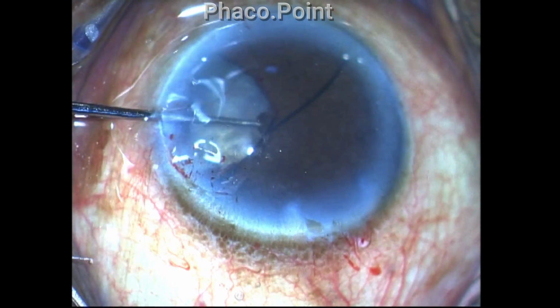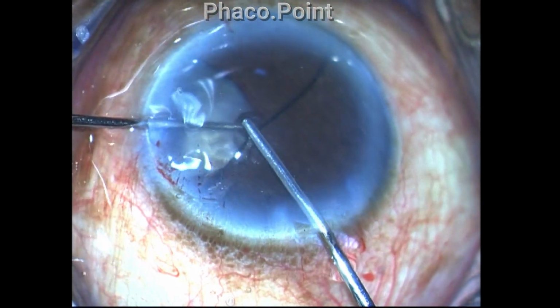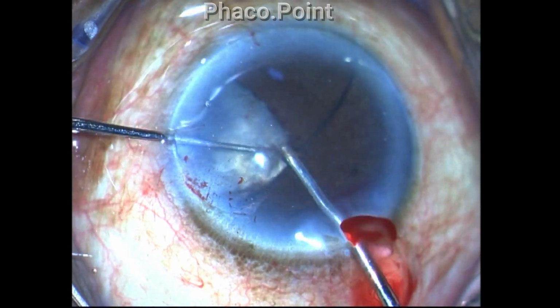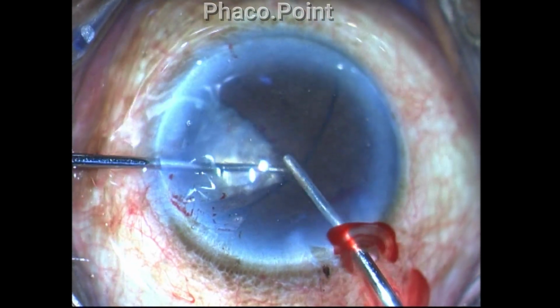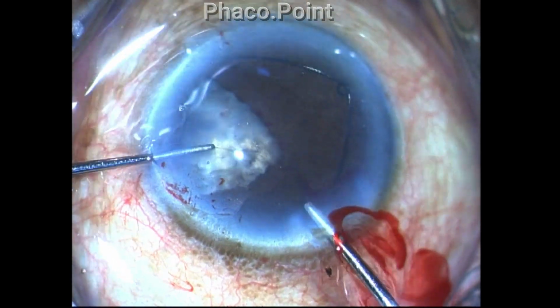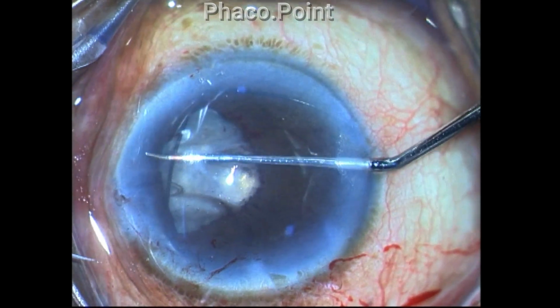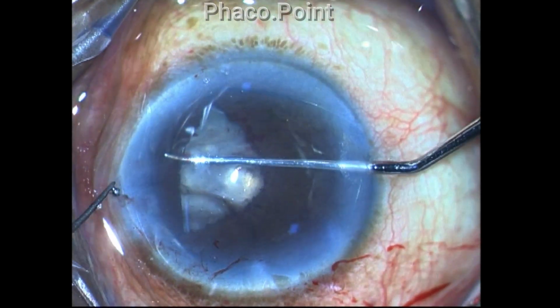Now this is when I started suspecting that there could be a sphincter sclerosis. A little amount of blood is also seen from the area of small iridodialysis. So I decided to do a pupillary stretch. I started by using a Y hook and a Coughlin's hook to create the pupillary stretch.